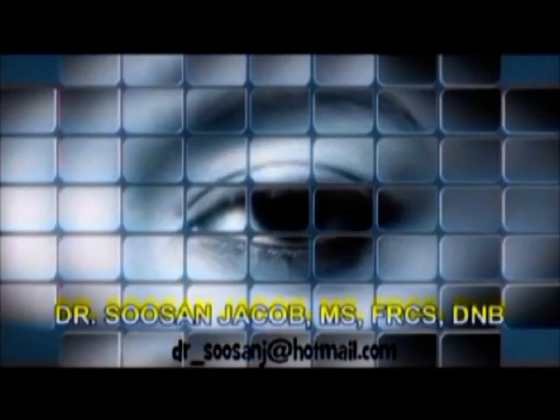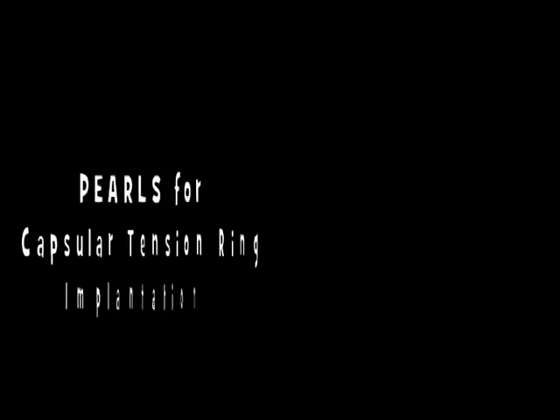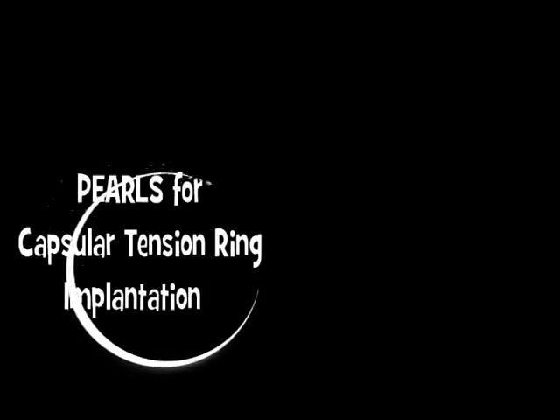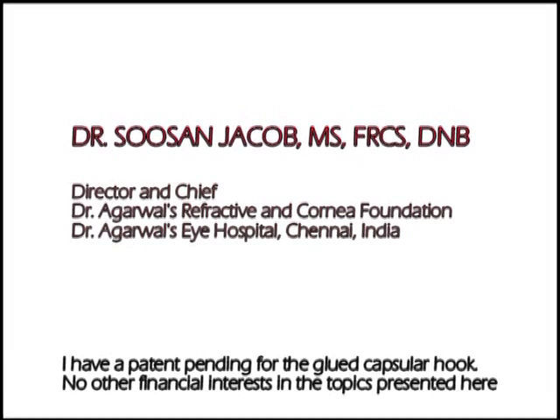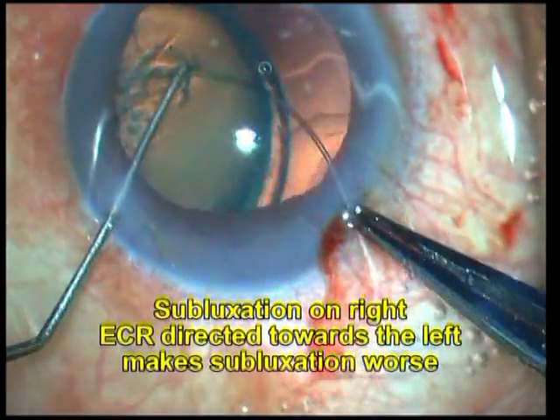Hi everyone, I'm Susan Jacob and in this video I'm going to share some tips on CTR implantation. I do have a patent pending for modified versions of the glued capsular hook which I show later on in the video. For this teaching presentation, I have borrowed some training surgeon videos just to show how certain complications can be avoided.